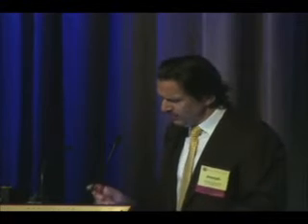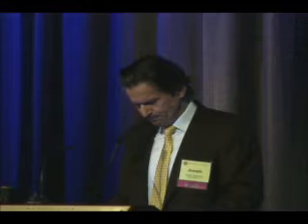With respect to trend analysis, here's an example of rim area changing over time in sequential photographs over a period of about 6 years. This next example is one I pulled from the literature. This regresses a series of cup-shape measurements over a long period of time. And that red line indicates where the visual field became abnormal. This was an ocular hypertensive patient who was followed over a period of about 8 years or so. So, some information here about rates.